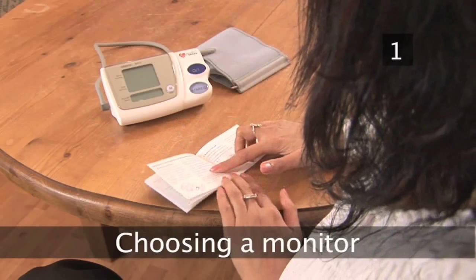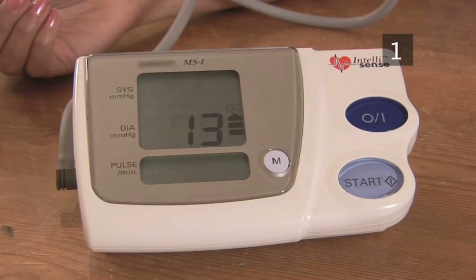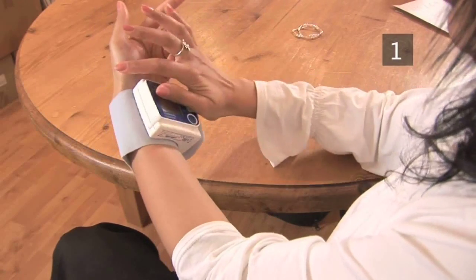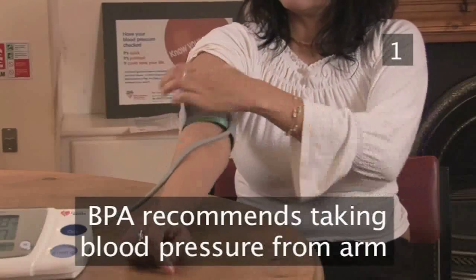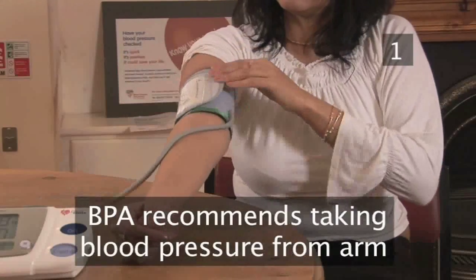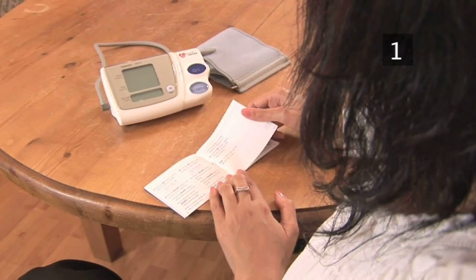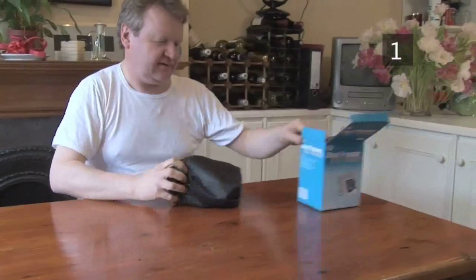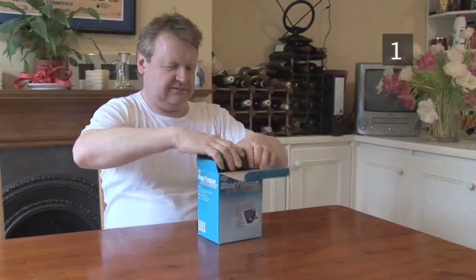Step 1: Choosing a monitor. Most modern blood pressure monitors are digital, and different monitors can measure your blood pressure from your arm or wrist. The Blood Pressure Association recommends using an arm monitor as they tend to be more accurate. The most important thing is that you use one which has been clinically validated. To ensure that it remains accurate, you should return your monitor to its manufacturer every one to two years to have it recalibrated.